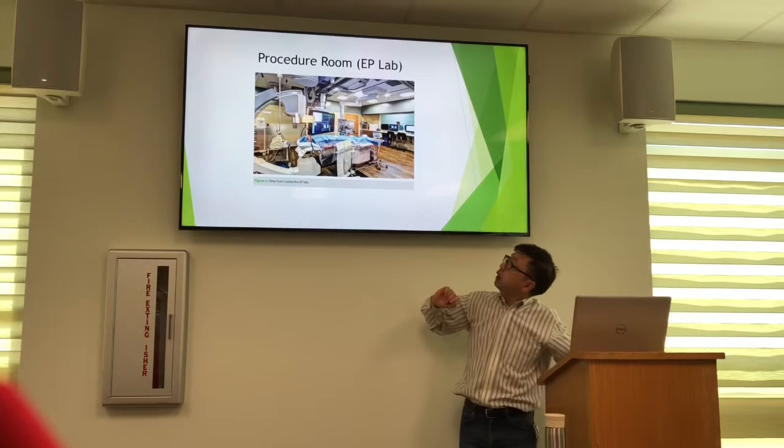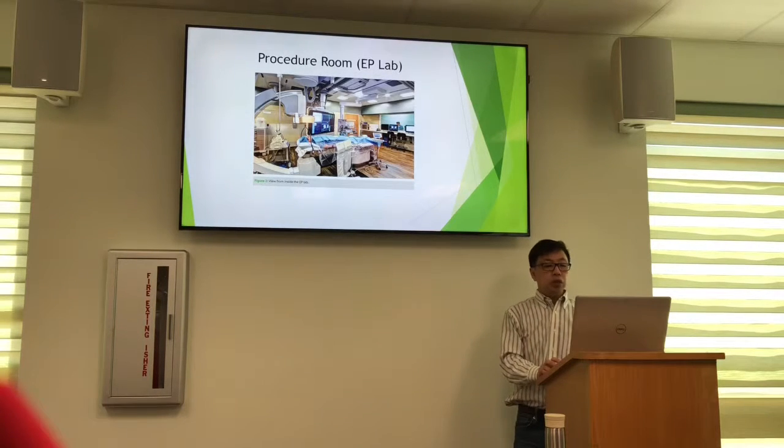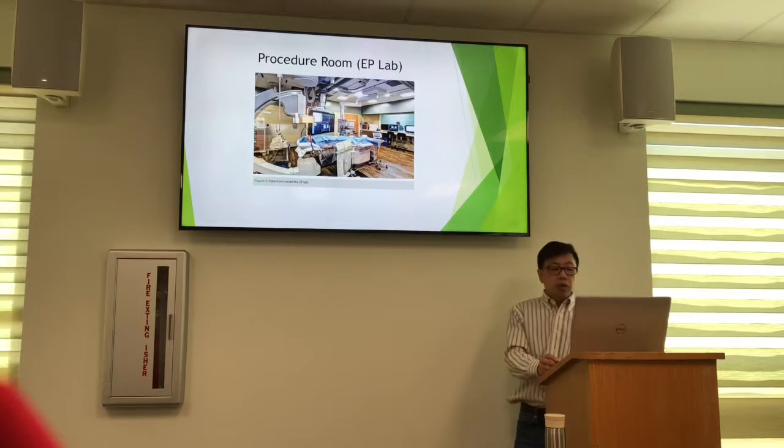Now, this is how the EP lab looks. The patient is usually lying flat on the table. The patient will be hooked up to the monitoring system to monitor all the vitals throughout the case. Here are all the personnel going to be in the case.